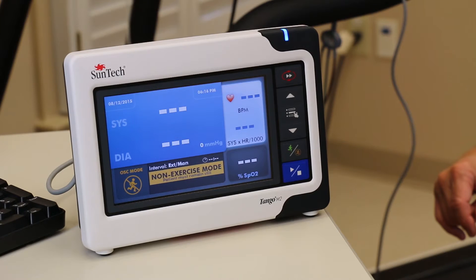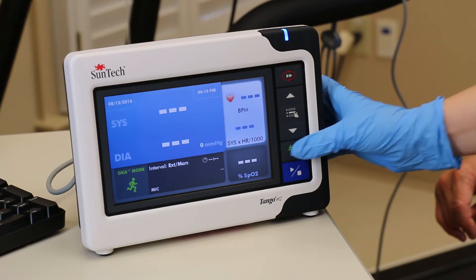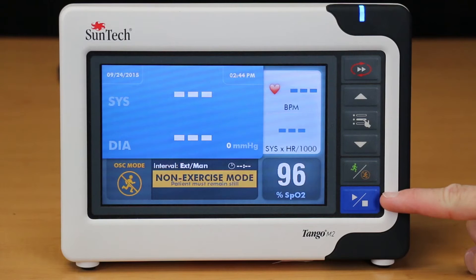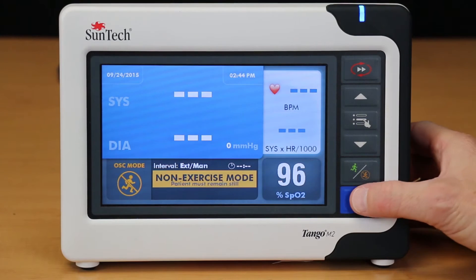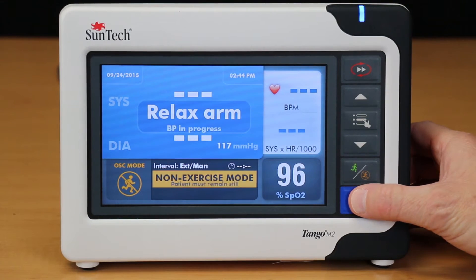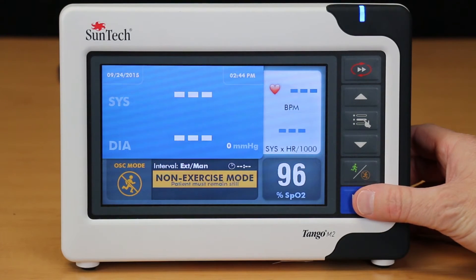To return to DKA mode, simply press the DKA OSC button. The Start Stop button is used to manually initiate a BP reading or to manually abort a BP reading that is in process.